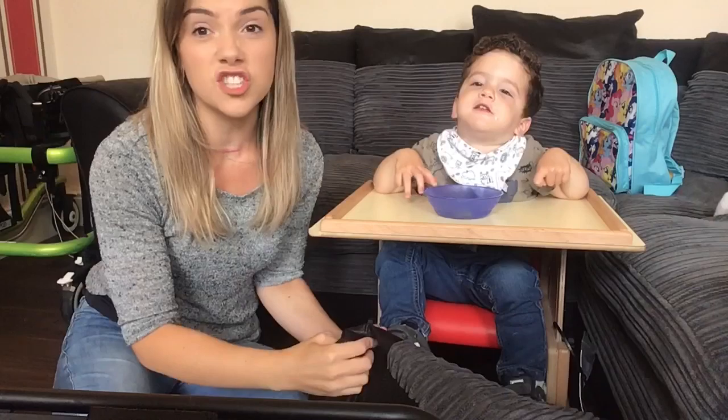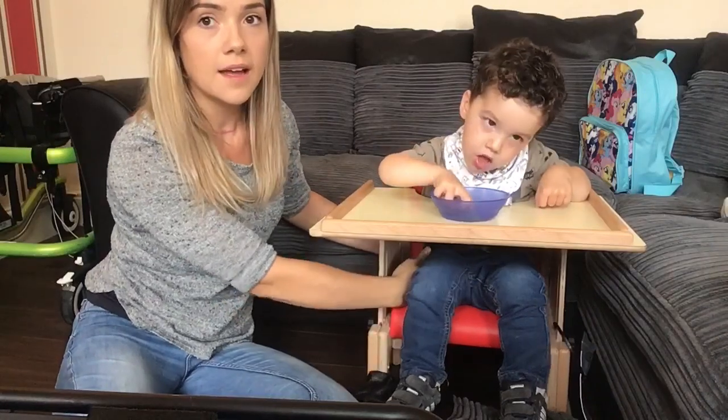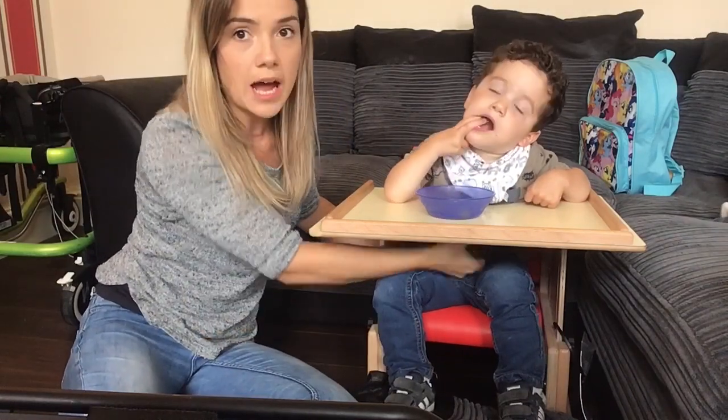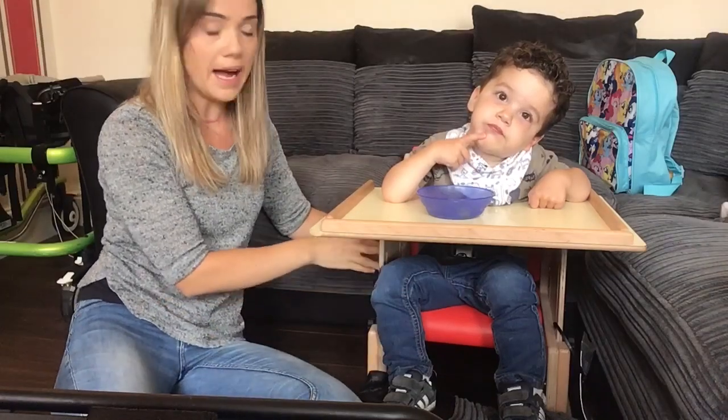So we've used a cushion — you can use a cushion. Wilson's feet don't quite touch the floor, so you can also get cushions for it. It slots in, or you can just roll up towels yourself. It's just a strap in the middle here — just like a clip strap and it tightens at the back.